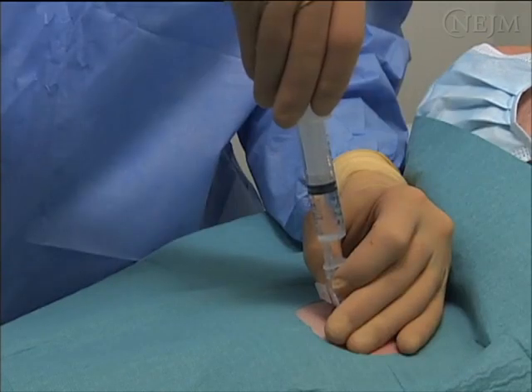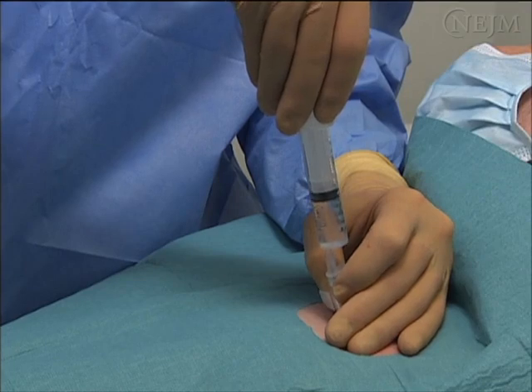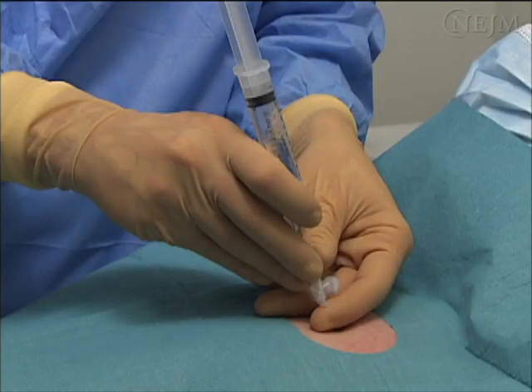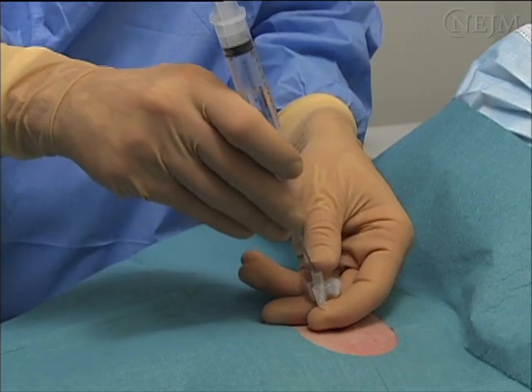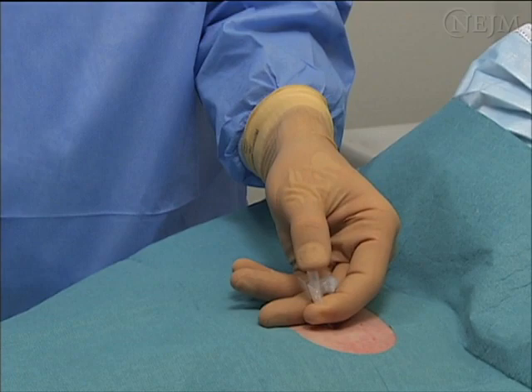At this point, move the needle forward a few millimeters to allow the catheter tip to fully penetrate into the pleural space. The appearance of air bubbles will confirm that the catheter has progressed into the pleural space. Ask the patient to exhale or cough to prevent air from being sucked into the pleural cavity. Remove both the catheter needle and the 10 ml syringe. Immediately cover the opening of the catheter with your finger to prevent the entry of additional air into the pleural cavity.